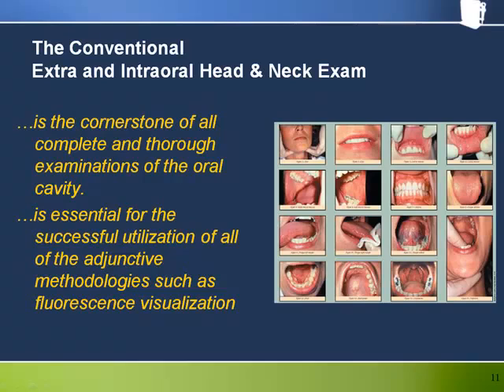The best decision for your patient comes from considering all the information available that includes not only physical examinations, but also medical history, risk factors, etc. In fact, as you'll be reminded when we start looking at the clinical cases, knowledge of an area's appearance under white light is crucial to making sense of its appearance through the VELscope.